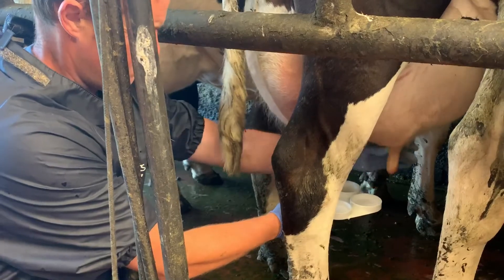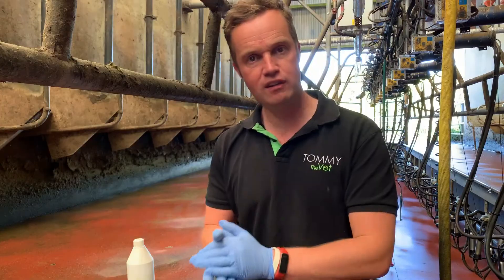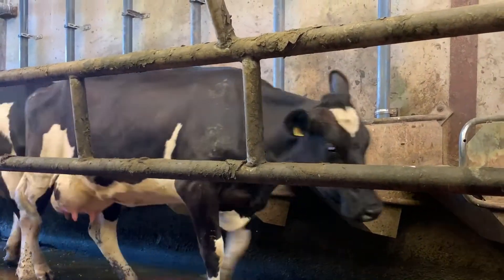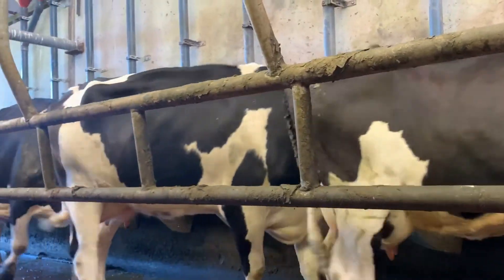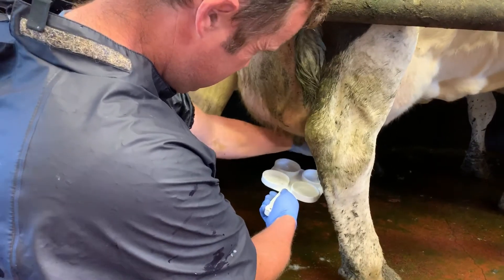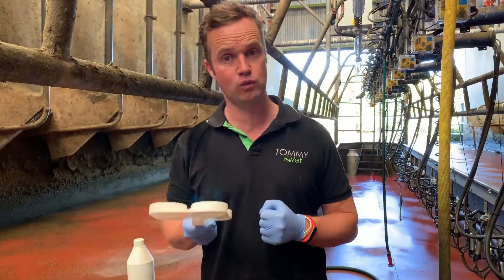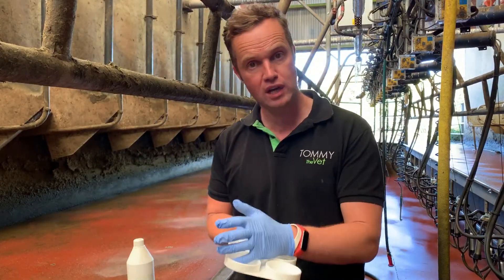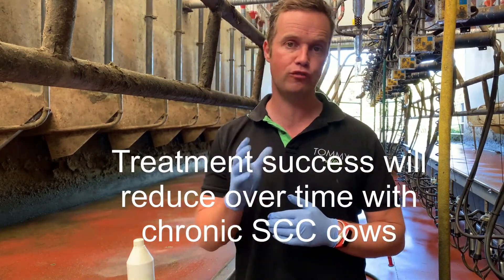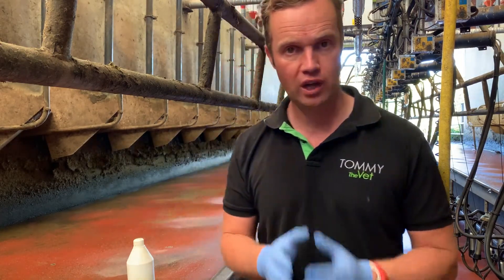It also becomes really useful when making decisions based on milk recording. We look at persistently infected cows and recently infected cows and decide on the history of that cow: which quarter is it, will I treat it, will I dry her off? All those decisions are helped by identifying the quarter. After treatments, we can go back and CMT test that infected quarter to see if we got a resolution. If a cow is reoccurring, remember the likelihood of successful treatment drops off dramatically, and those cows are a source of infection for other cows in the herd.